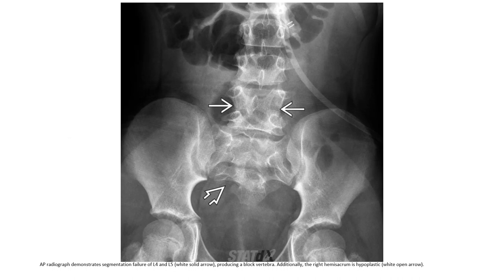AP radiograph demonstrates segmentation failure of multiple vertebral levels, producing a blocked vertebra. Additionally, the right hemi-sacrum is hypoplastic.